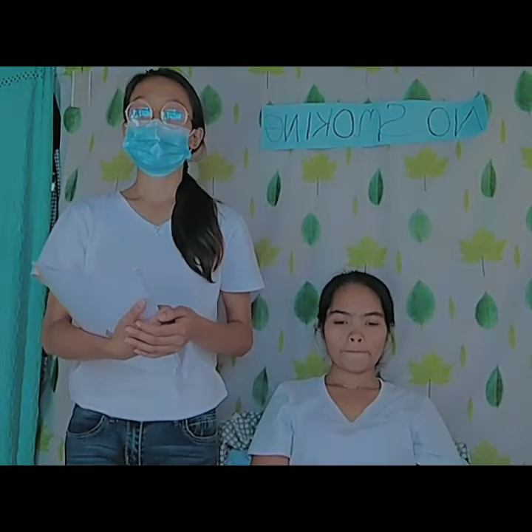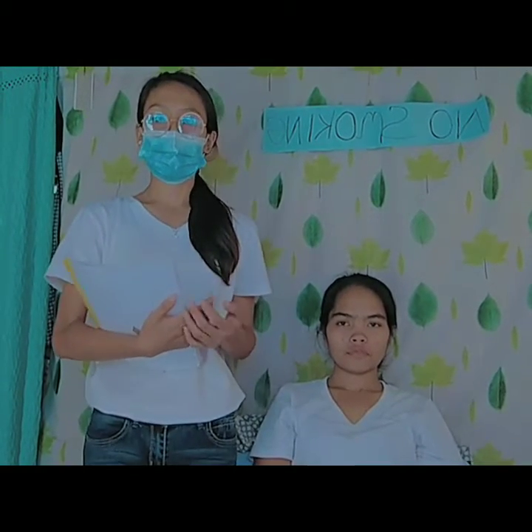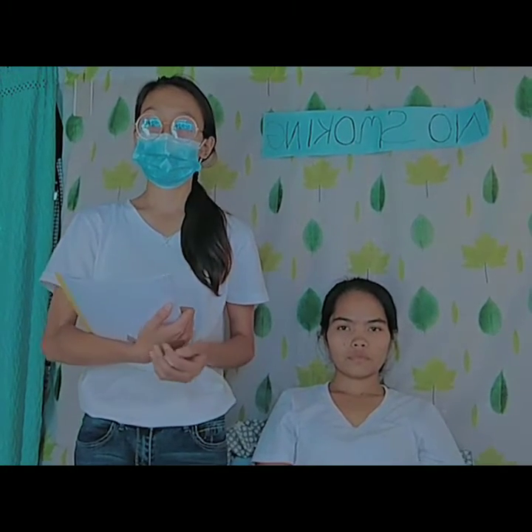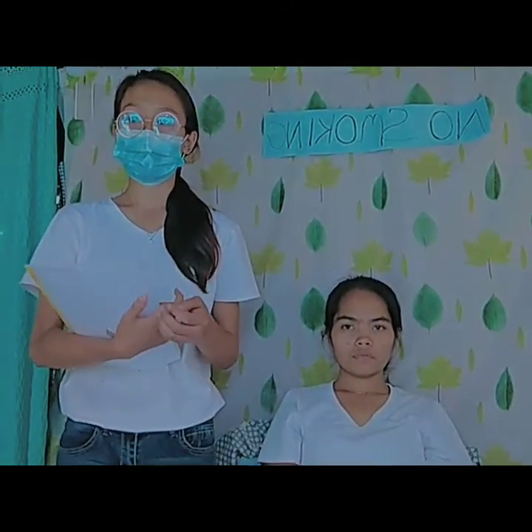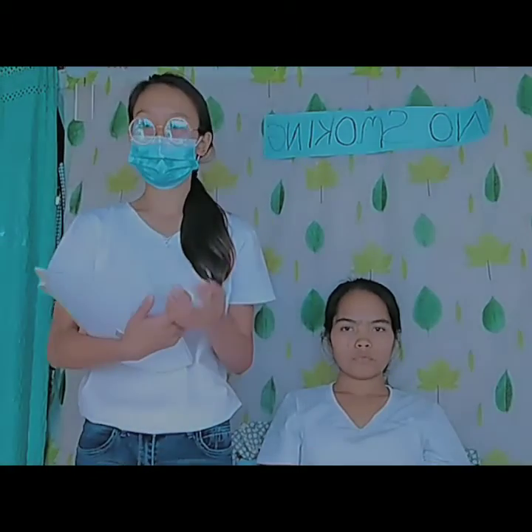After that, we are going to insert the flow meter into the wall outlet, then attach oxygen tubing to the nozzle on the flow meter. If using a high oxygen flow, attach a humidifier and attach the oxygen tubing to the humidifier. Then we are going to turn on the oxygen at the prescribed rate and check if the oxygen is flowing through the tubing.